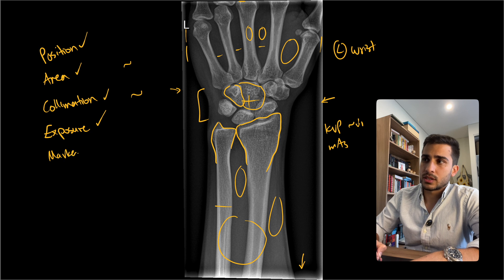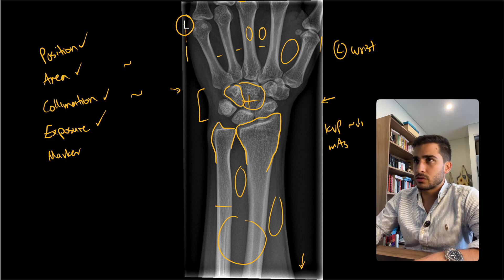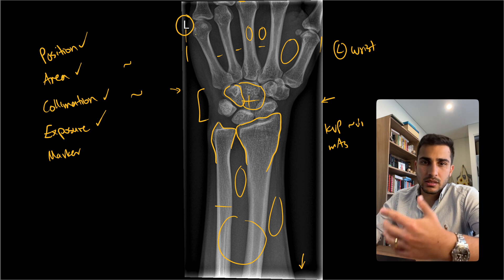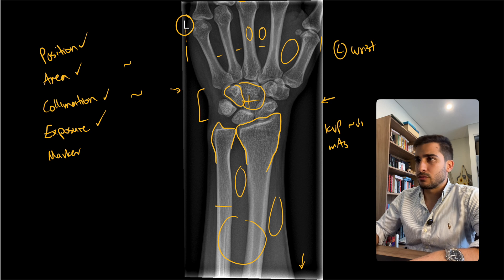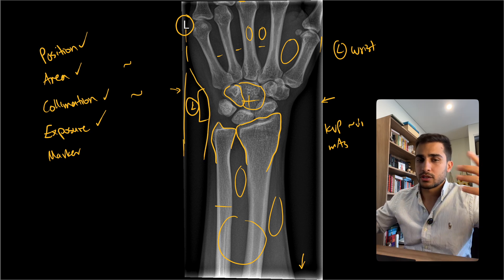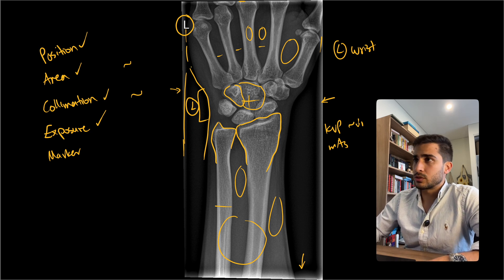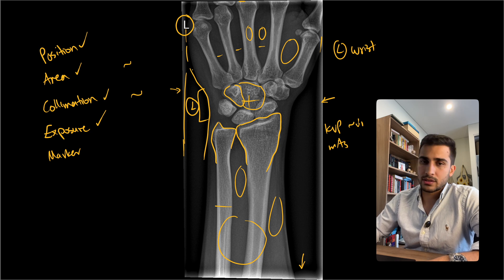Next is marker. They've used a digital marker and placed it quite close to the anatomy because of how tight the collimation was. Not bad, but ideally I like to put the marker next to the joint of interest. In this case, looking at the wrist, there's a natural opening next to the wrist — that's prime real estate for where your marker should go. Otherwise, it's the correct marker for the left wrist and on the lateral side, so pretty good but could be improved slightly.